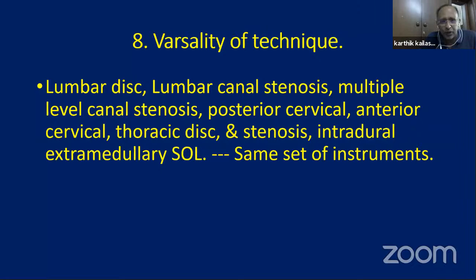Now that Destandau and UBE seem to be the current favorite baby as far as publicity is concerned, in terms of versatility, could you give us beginners the advantages of Destandau as compared to the UBE, or whatever the risk factors involved? We have already discussed a lot of advantages of the Destandau. Now let me speak on the advantages of the UBE.